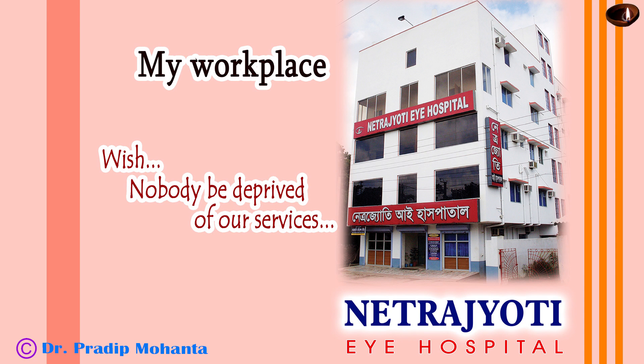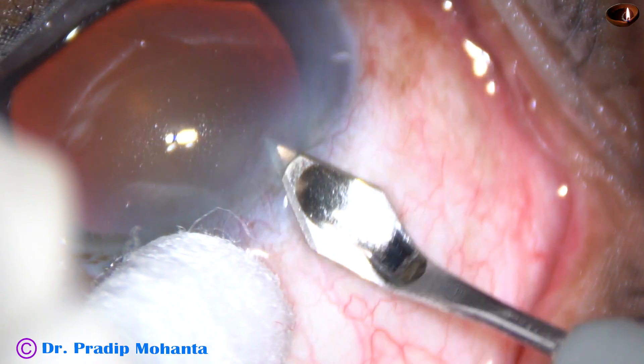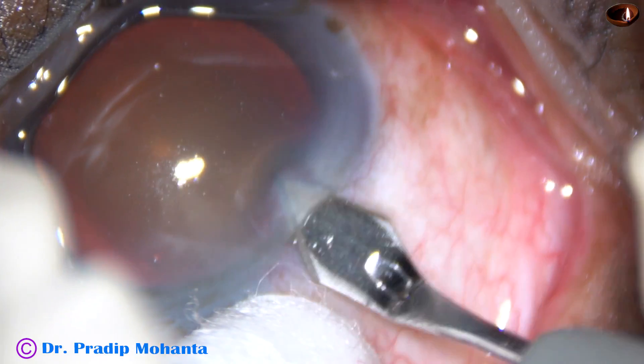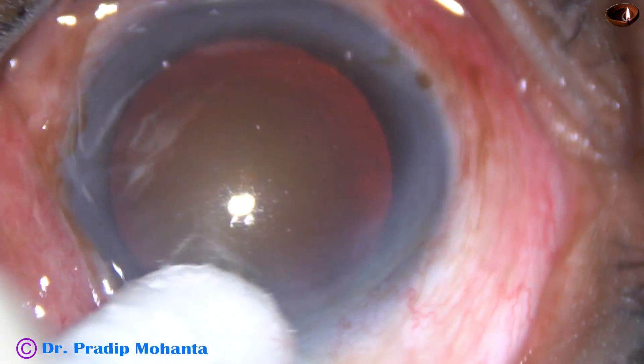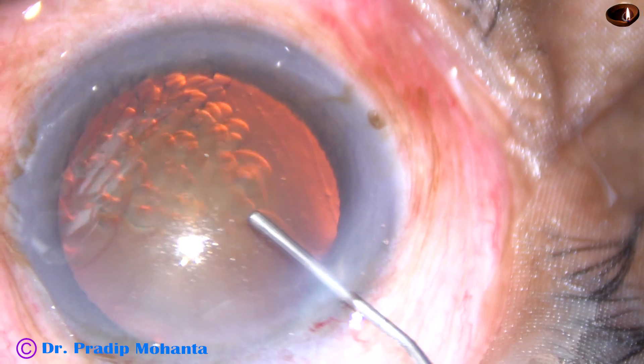Friends, welcome to my hospital at Ranaghat, India. This is phacoemulsification of a cataract with grade 3 nuclear sclerosis. This is a totally unedited surgery. The main incision has been placed.